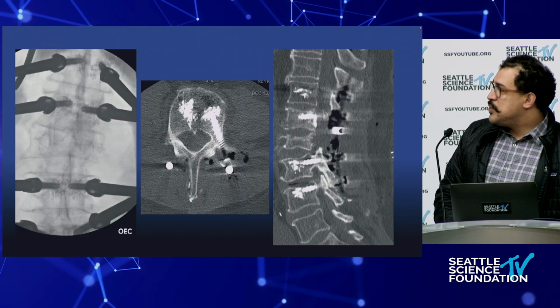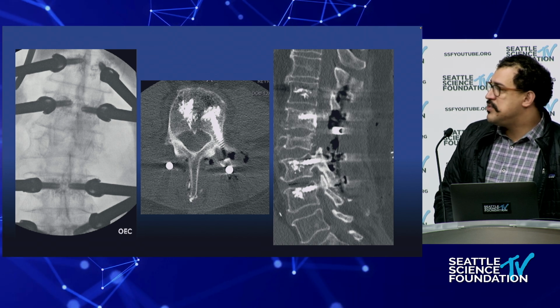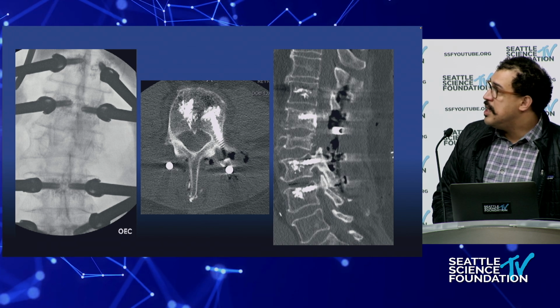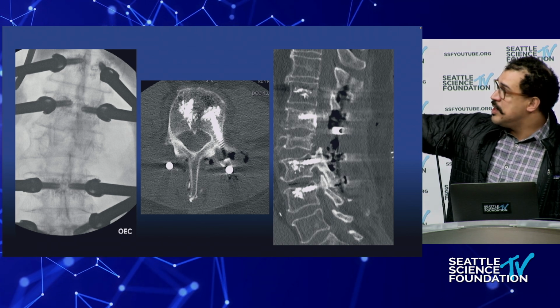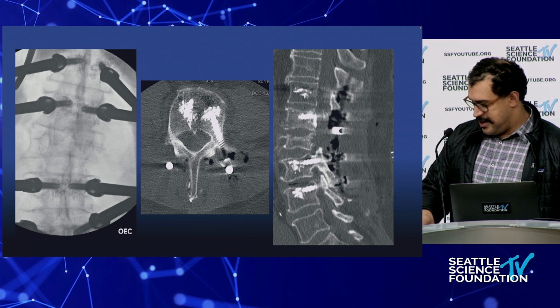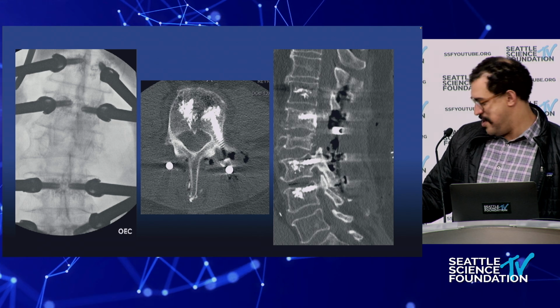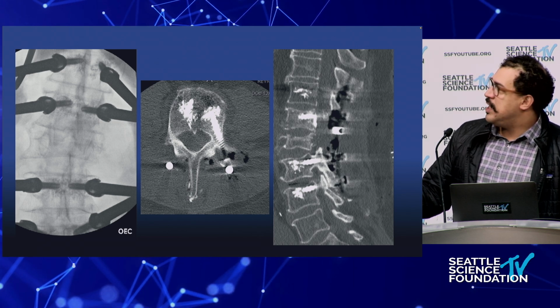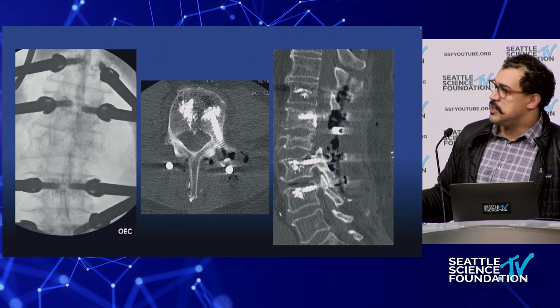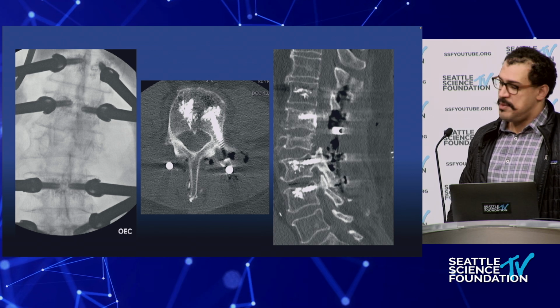So just going back to our patient here, used about 1.5 cc's in these screws. These were fenestrated screws. You see very well contained. But up here, a little bit of extravasation into that posterior wall. And I'm going to pull this up here with the pointer. But right here, having extravasation is going to be a very common occurrence. This was not enough to be symptomatic, fortunately, but unquestionably something to consider.